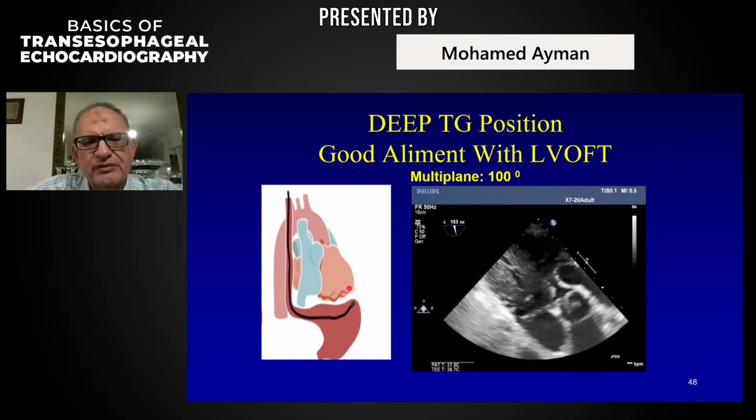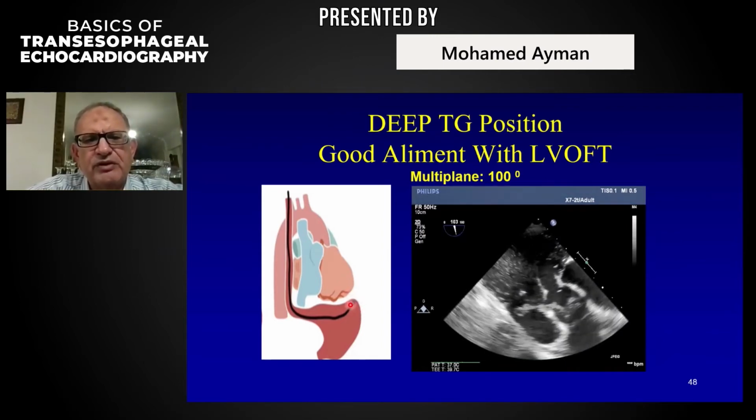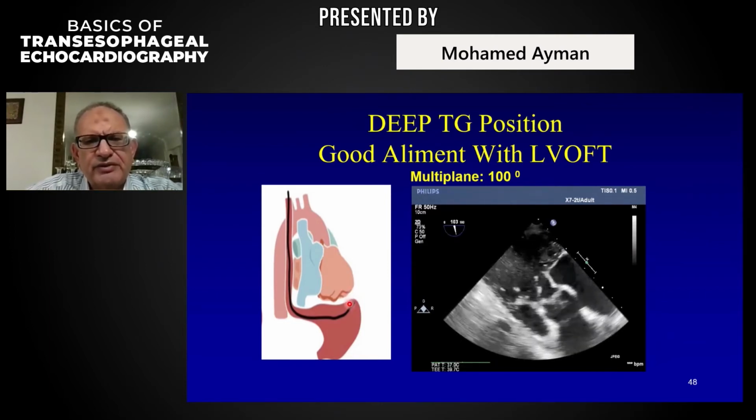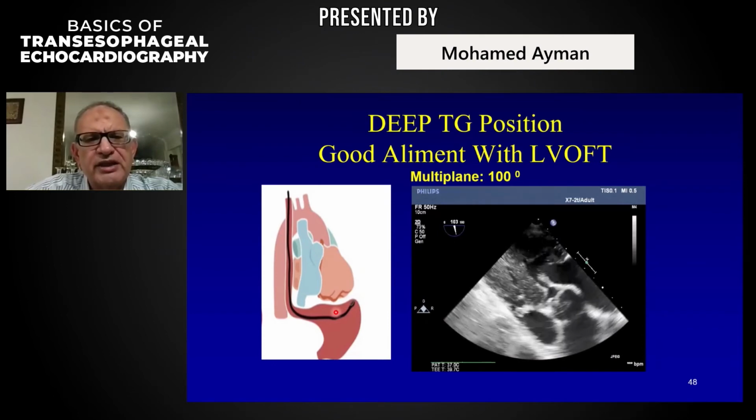the left ventricle, under the diaphragm, opposite to the apex of the left ventricle. Here I am foreshortening the apex. I can't see the apex.